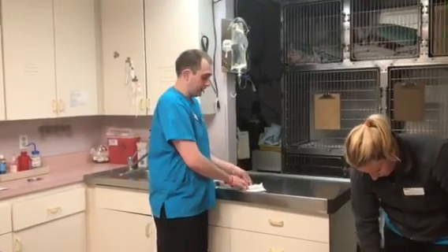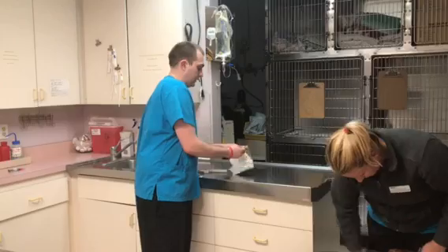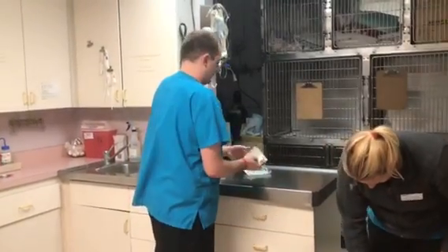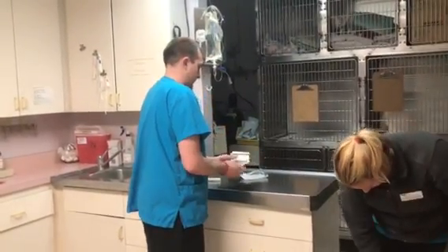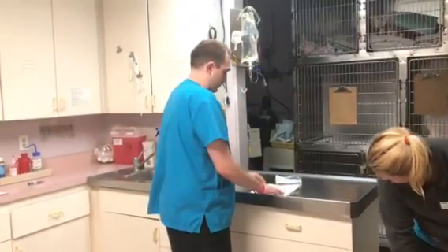I'm going to show you how to place a urinary catheter in a dog. This is a sterile procedure, so you do one of these sterile. These are the two sterile gloves. There's a little left and right label here, so it makes it pretty simple.